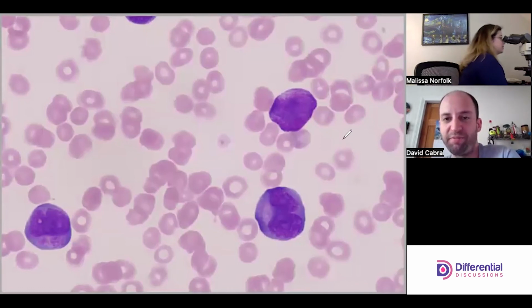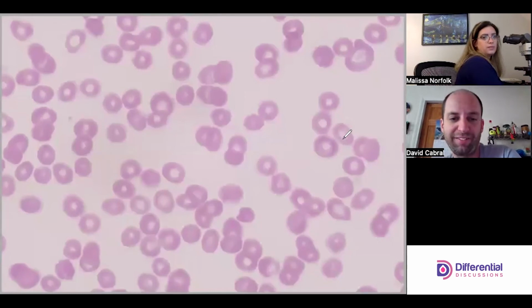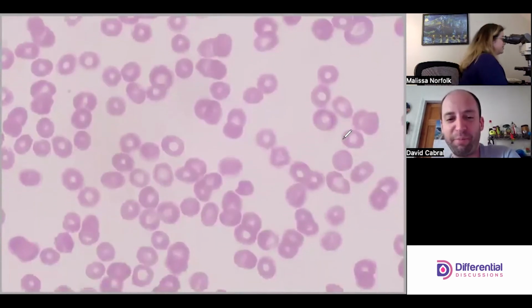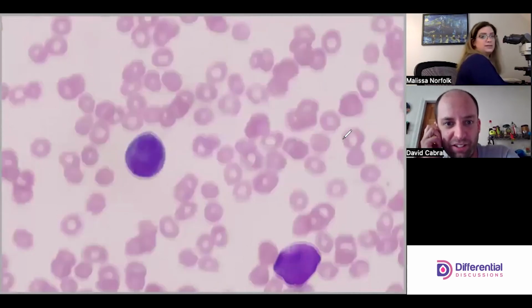Let's look at the other one that's up there. And one more. Wrong direction, Melissa. Hey, the fact that you keep it organized at all. Oh, I just pulled them out. Right there. Yeah.